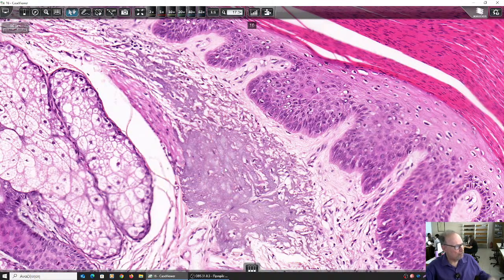This is basophilic degeneration. That means that this skin is so sun exposed, and there is so much damage from the sun that when we see that in the dermis, it looks older even than my skin. See? It looks older even than my skin.